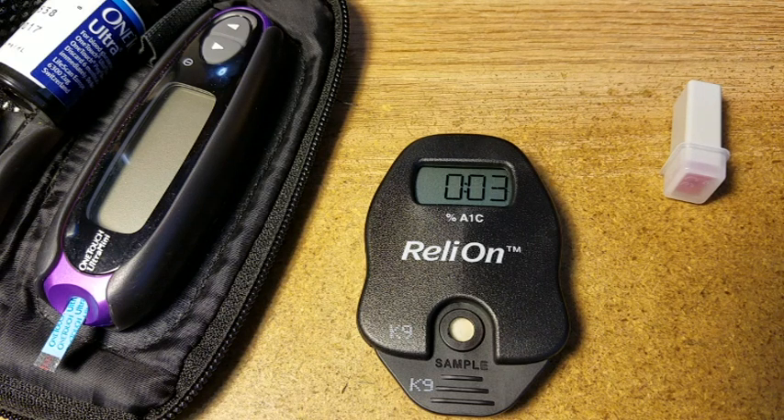Alright, here we go — we're getting our results. Quality control is okay. 7.4. That's still kind of high, and it tells me that my blood sugar hasn't really been maintained as well as I should have. 7.4 — that's a lot higher than my phone predicted at 6. Anything in the 7s I guess is okay, but 7.4 is kind of high, which means I haven't been taking care of it as well as I thought.